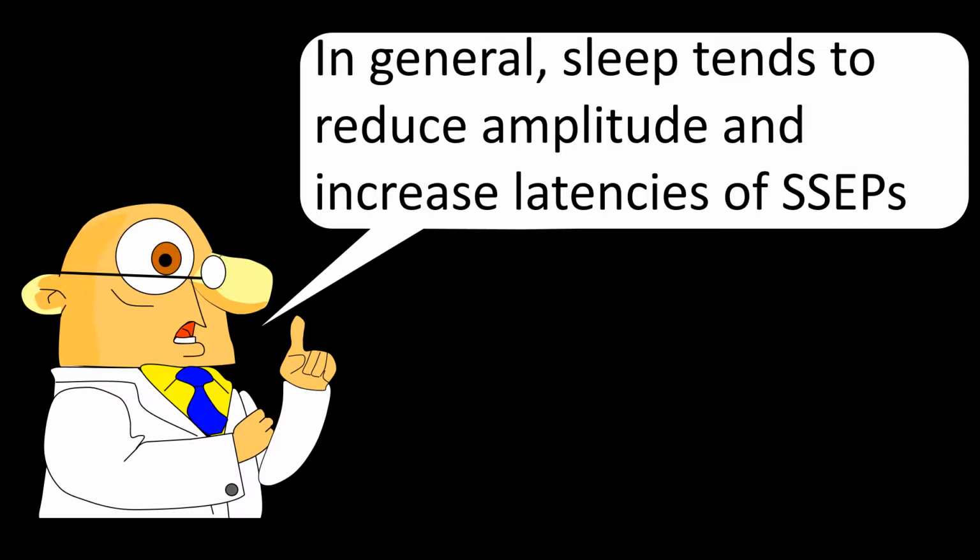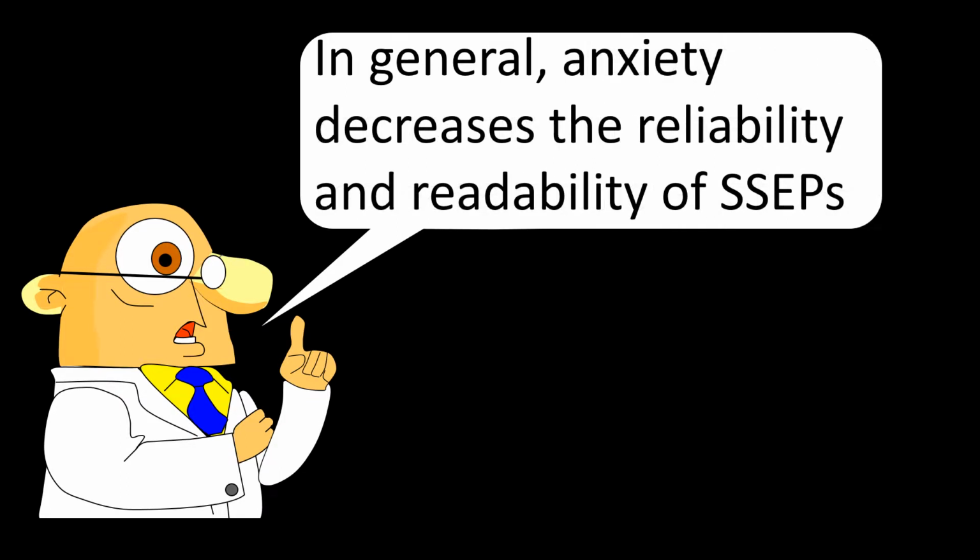It is also a general feeling that there's a reduction in amplitude. This reduction in amplitude seems to be more consistent than the increase in latency. Another generality that we can make is that anxiety decreases the reliability of any somatosensory evoked potential study.